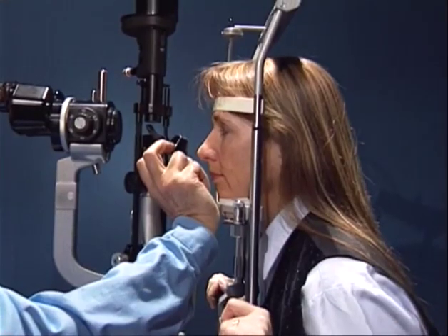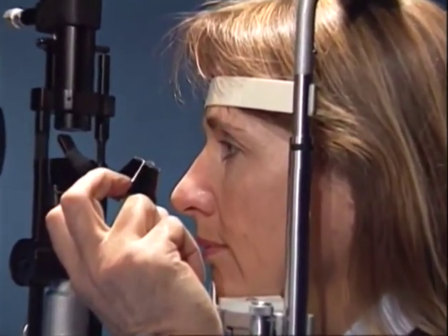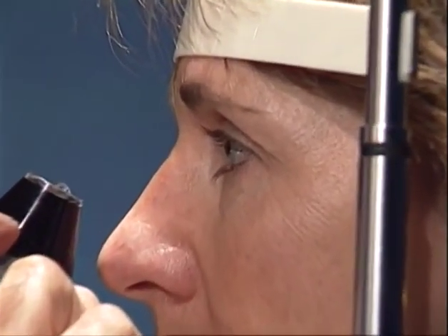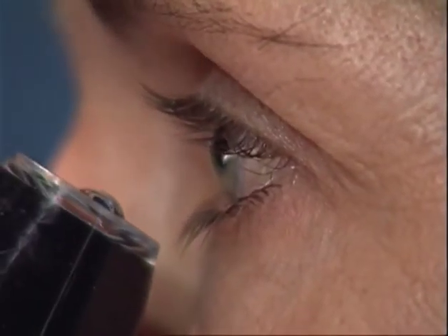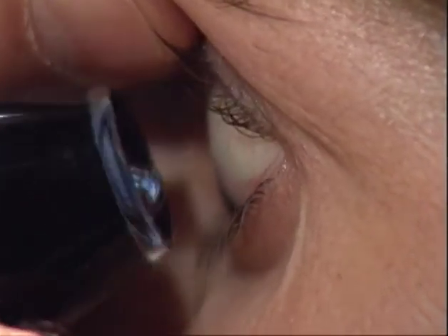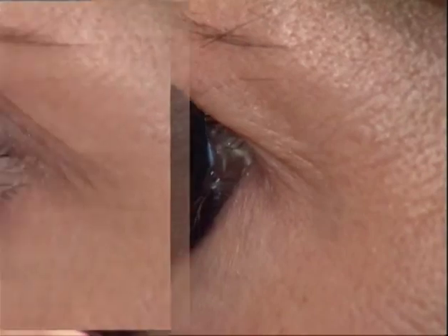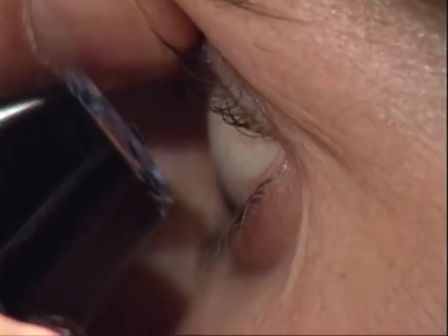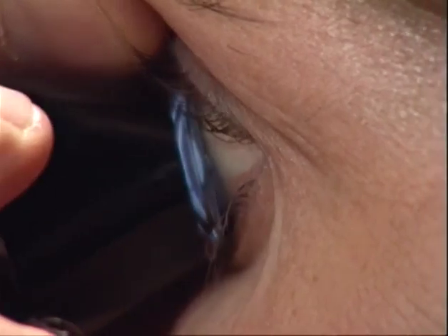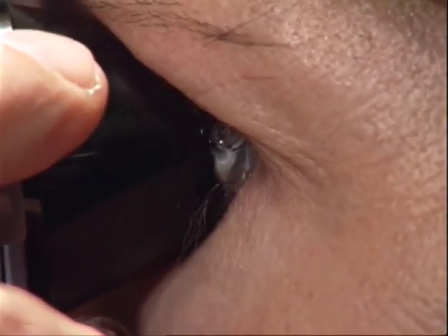There is also a second method to insert a contact glass. It is usually a two-handed procedure. The patient is asked to look downwards so that the lower lid is automatically retracted. Now it is the upper lid which must be lifted by the examiner. This usually requires the use of the second hand. The contact glass is now applied to the sclera at the upper limbus and tilted downwards until it is in contact with the cornea, while the patient looks again straight ahead.